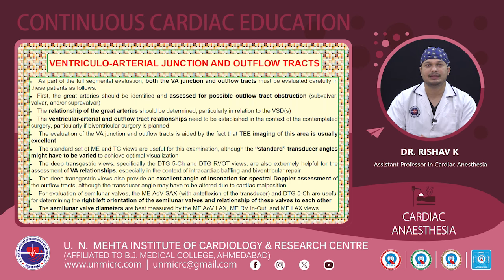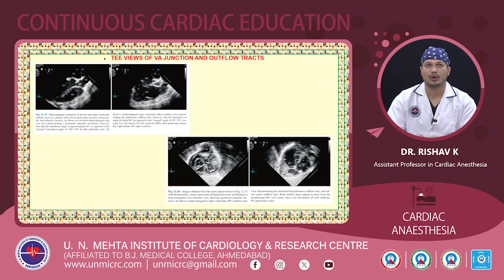The deep transgastric views are also very important in the context of intracardiac baffling and biventricular repair. They also provide an excellent angle of insonation for spectral Doppler assessment of the outflow tracts and for evaluation of semilunar valves. The right-left orientation of the semilunar valves and their relationship to each other can also be done with the help of the midesophageal aortic valve short axis view and the deep transgastric 5-chamber views. And the semilunar valve diameters also need to be measured by means of the midesophageal aortic valve long axis and the midesophageal long axis views.